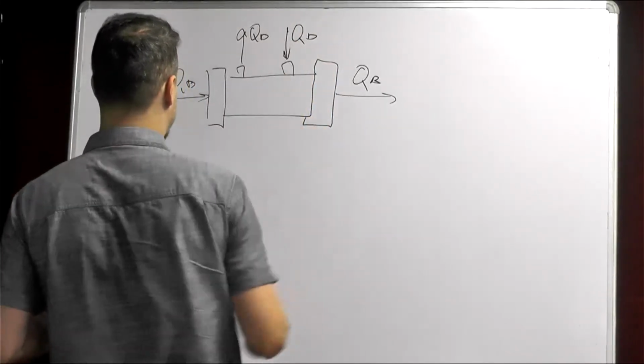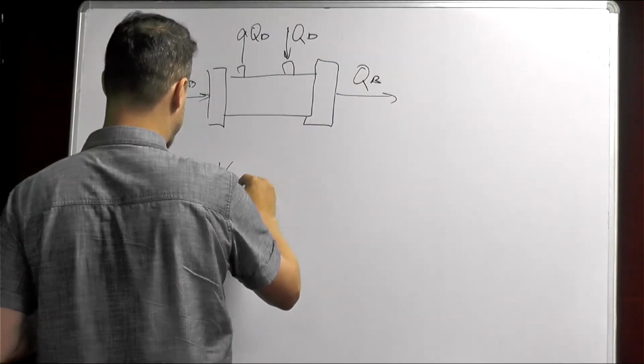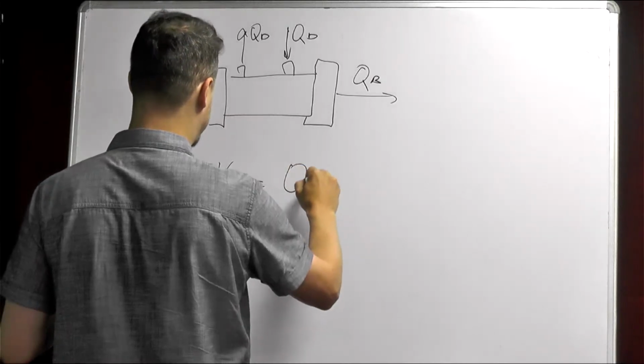Usually the most common way to evaluate the clearance of, let's say, urea is to use the following formula.